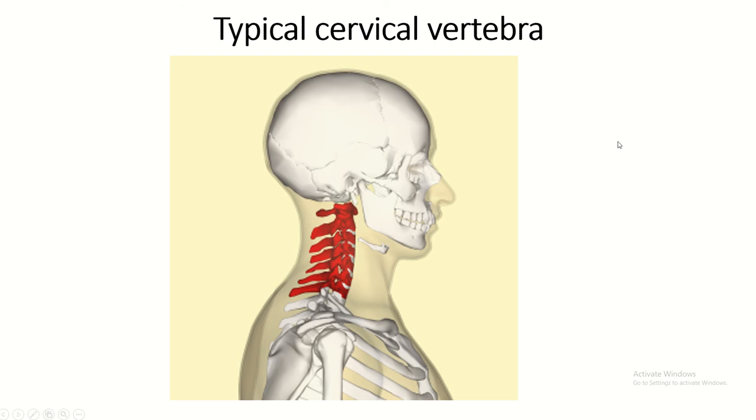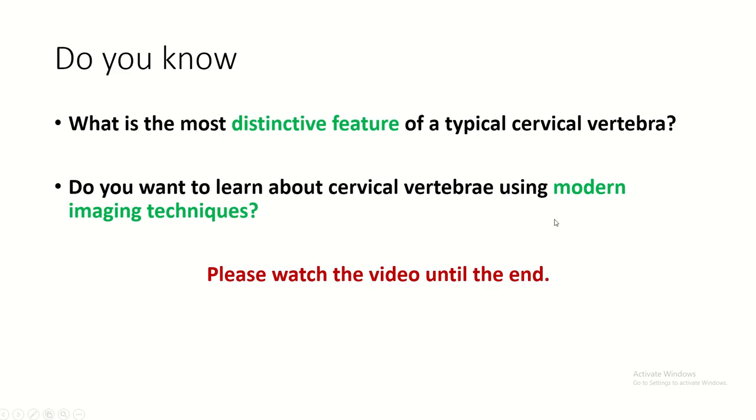In this video, I discuss the typical cervical vertebra. Do you know what the most distinctive features of the typical cervical vertebra are? Do you want to learn about the cervical vertebra using modern imaging techniques? Please watch the video until the end.